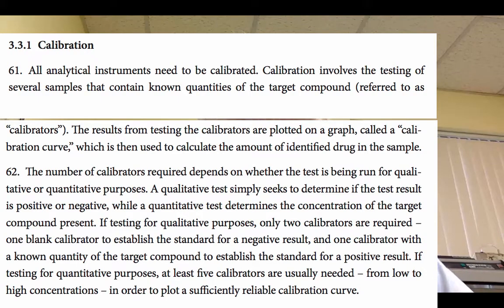The Mother Risk Inquiry Report made it clear in Ontario that across forensic science, any kind of analytical instrument needs to be calibrated. And we need to know that it is calibrated if it's to be reliable for a forensic purpose. So, if an Intoxilyzer 8000C is being used out in the field by a particular police officer, its reliability, its calibration doesn't come from something that the qualified technician does. Isn't that true, Mr. Crown Expert? It isn't something that comes from something that the qualified technician does on the subject test.